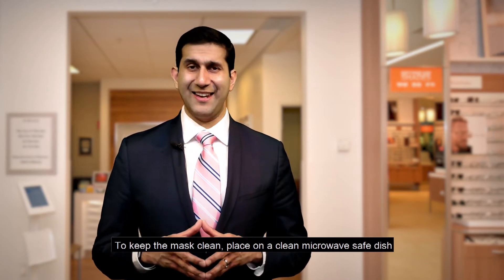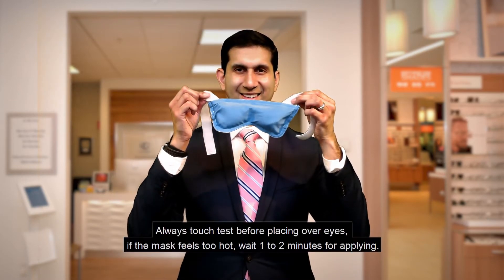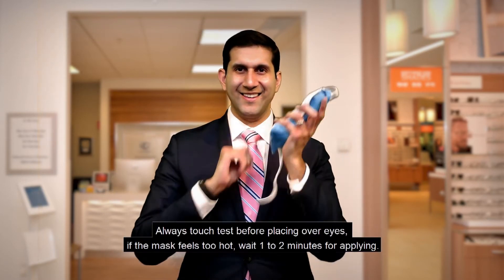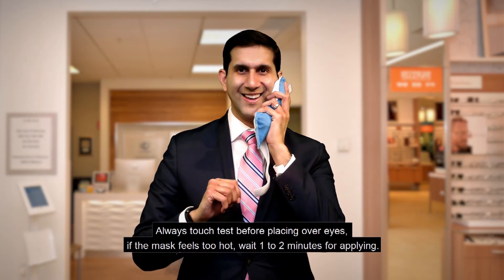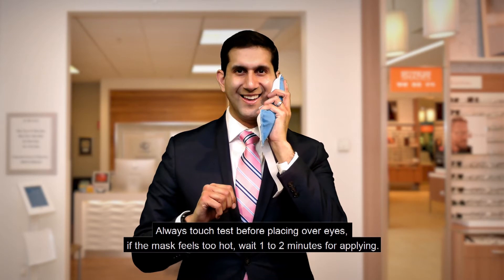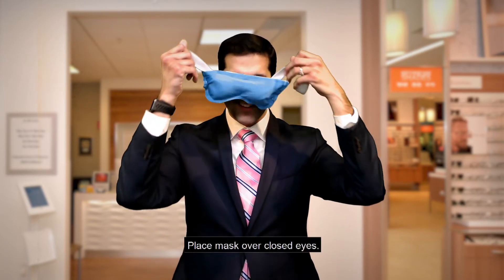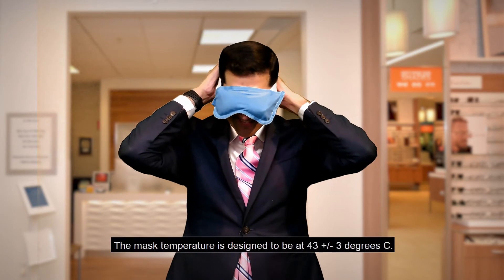To keep the mask clean, place it on a clean microwave-safe dish. We advise you to do a touch test before placing it over your eyes. If the mask feels too hot, wait one to two minutes before applying. Then place the mask over your closed eyes.